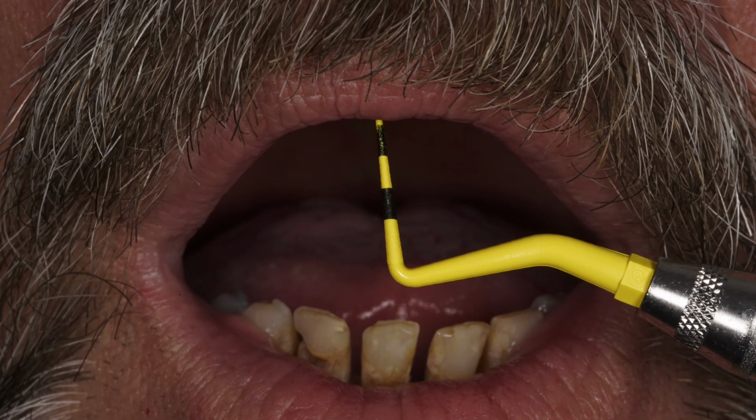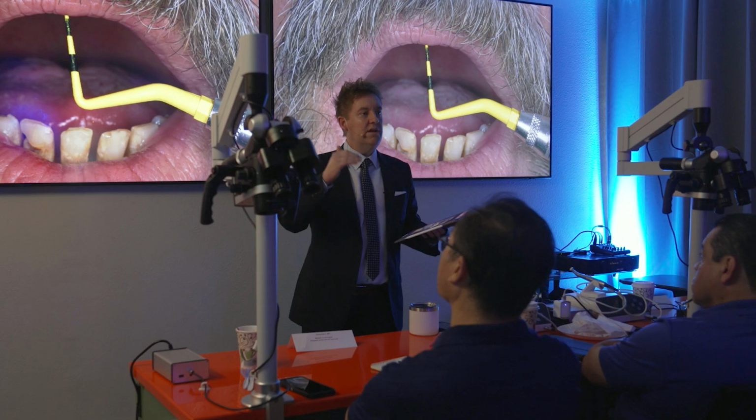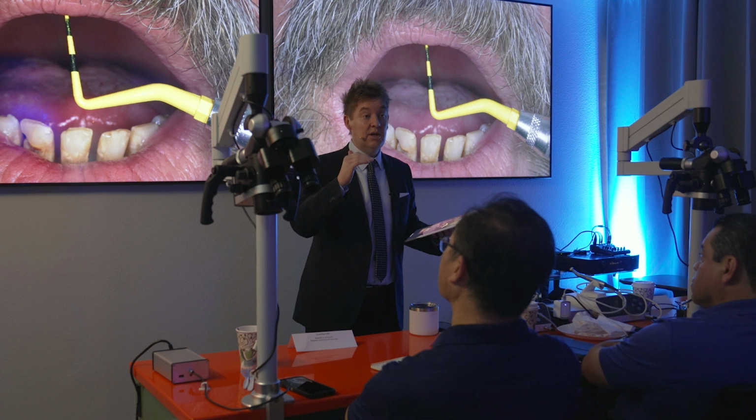And what do we call this image? This is his lip at rest position. We want to talk about this because this is our starting point, what you'll call tooth display in repose. And we know based on age how much of that central incisor, the maxillary central incisor, should be showing. And you'll notice he's not showing it at all.